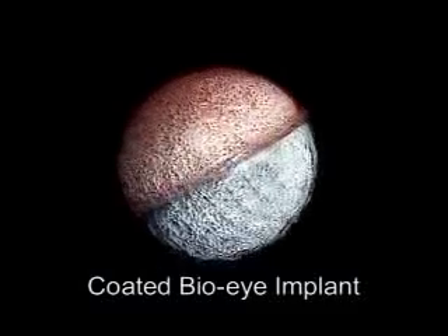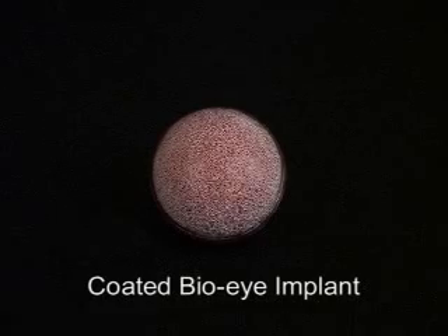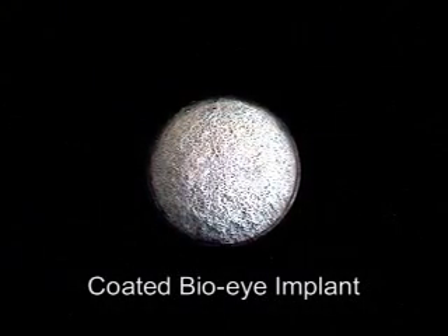These techniques are the same for a secondary orbital implant after the extraocular muscles have been isolated. In an evisceration, muscle windows may or may not be made in the anterior, amber-colored polymer, and more holes are made in the posterior or purple-colored polymer.